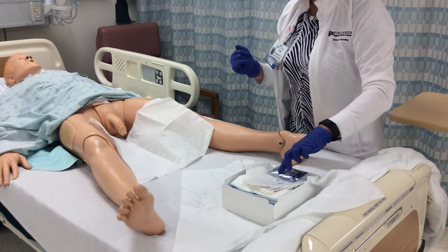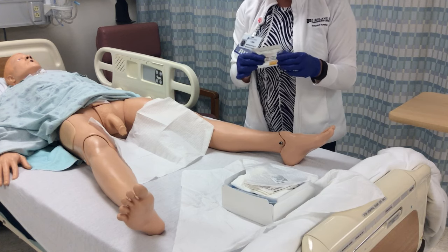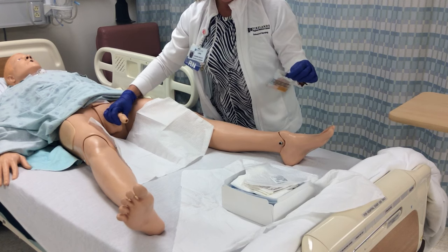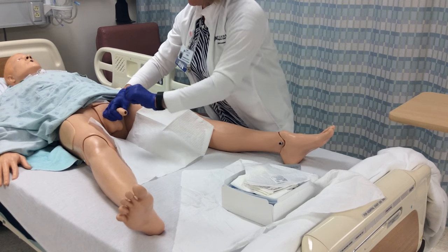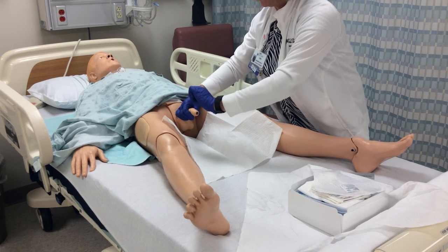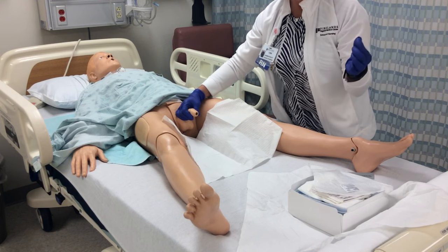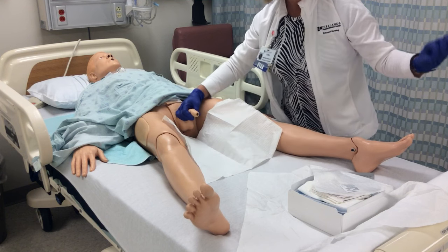Next, perform peri care on the male patient using the Castile wipes that come in the kit. Open the wipes and with your non-dominant hand grasp the penis. Using one wipe at a time, begin cleansing in a circular motion from the urethral meatus outward, then discard the wipe. Repeat with each separate wipe, beginning at the meatus, cleansing outward, and discarding.